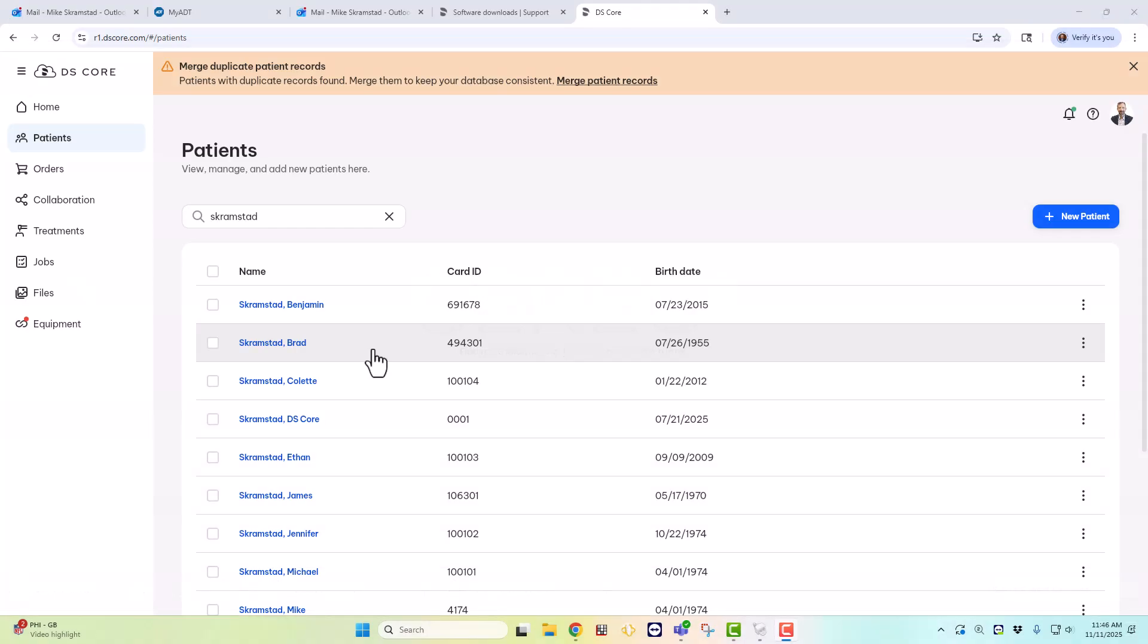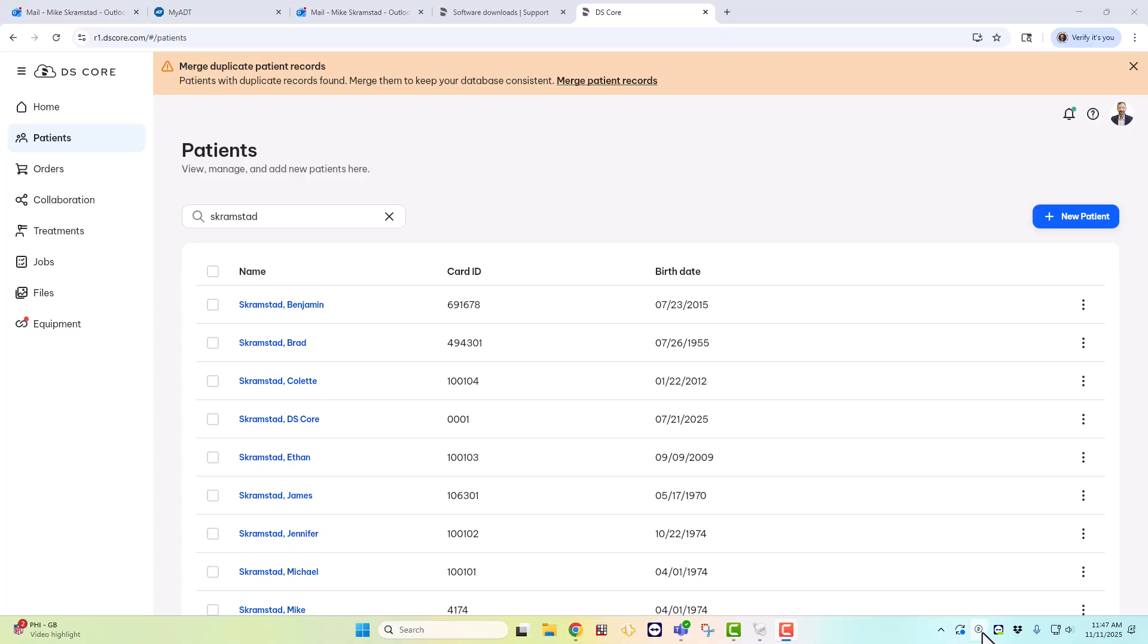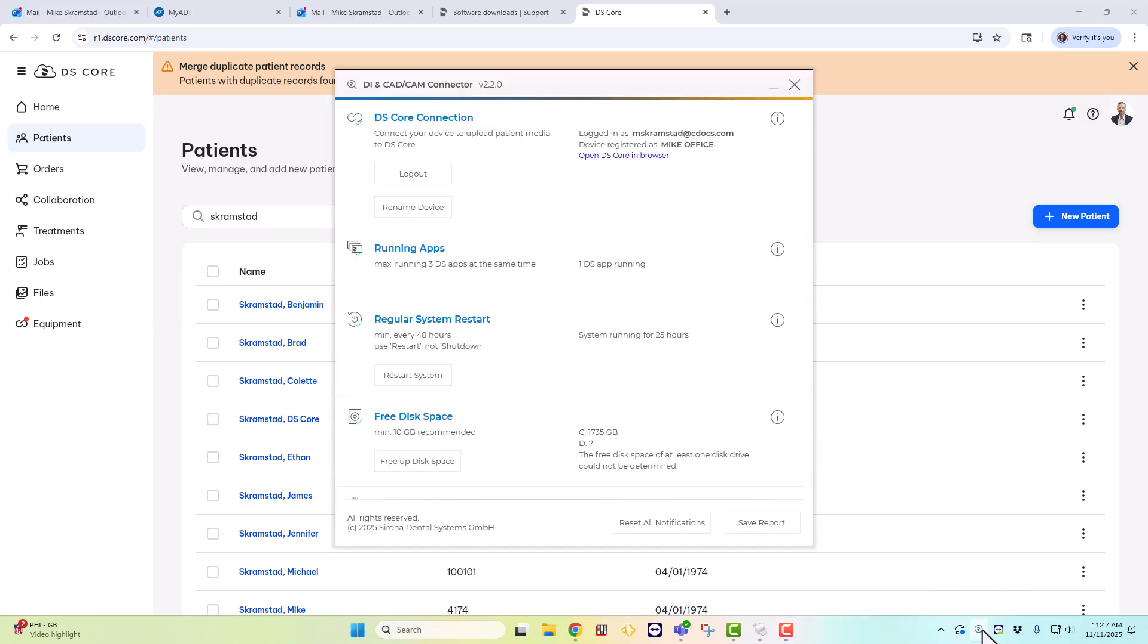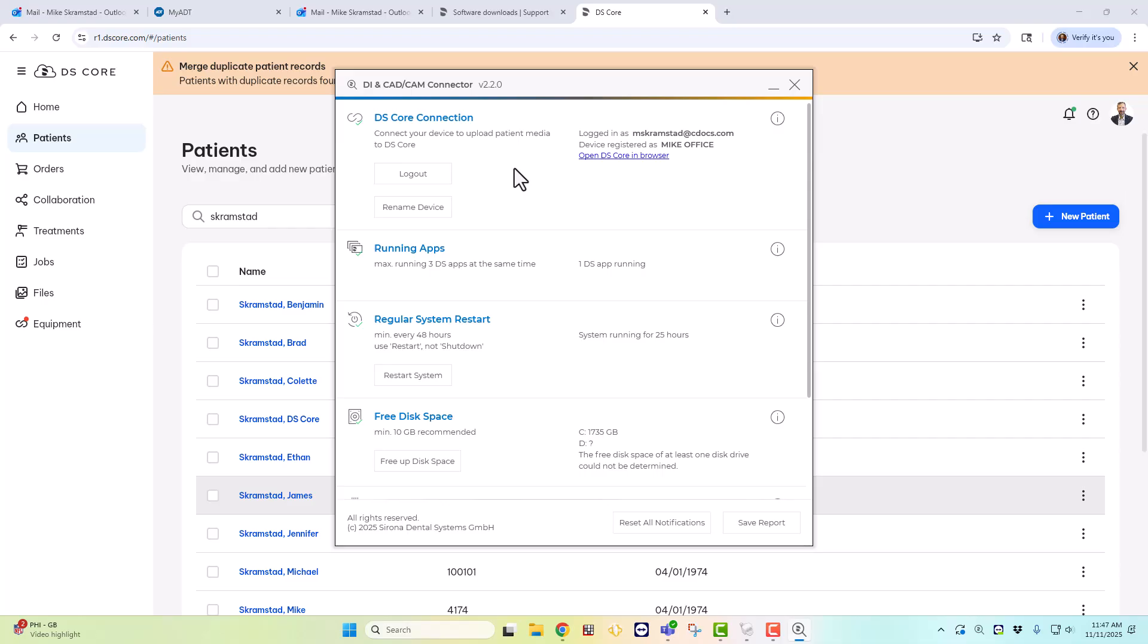Okay, so step number one is you need to make sure your PrimeScan has the DI and CAD-CAM connector loaded. So if you go to your PrimeScan acquisition center, make sure you have this little magnifying glass on the lower right in the taskbar. If you do have that, go ahead and click on that and make sure you're logged into the DS-Core connection. If you're not logged in, make sure you enter your username and password.